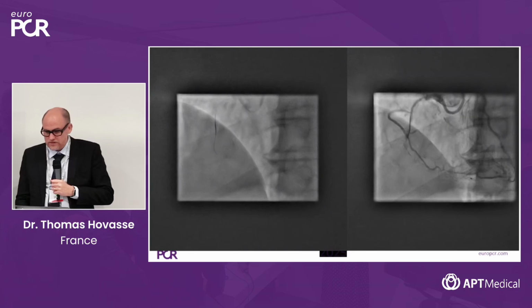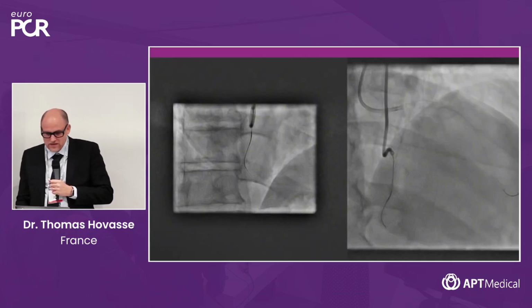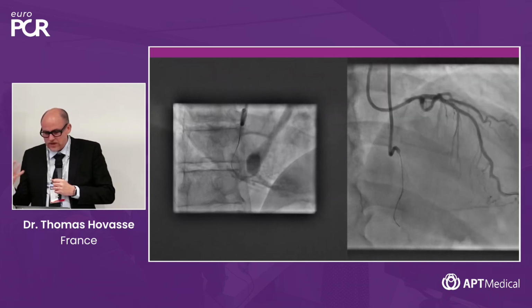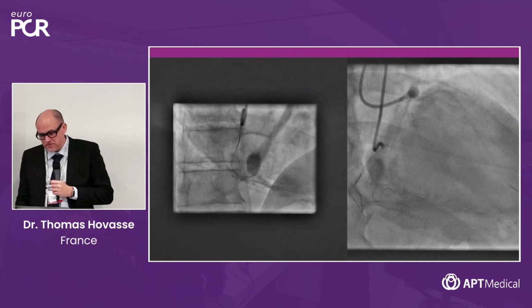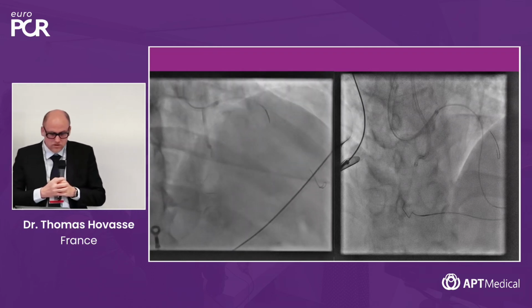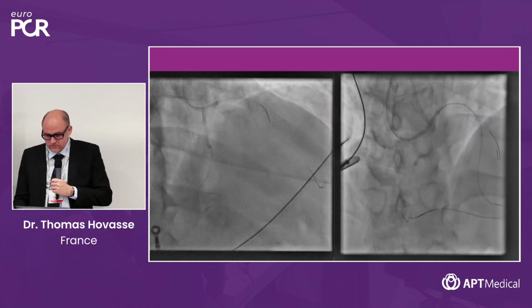So here it seems okay, but not really dancing with the distal part of the vessel. And we have to stop here the antegrade advancement because we were not going anywhere, and soft wires don't work, stiff wires are dangerous because the path is unclear. So again, the strategy was to advance the Corsair retrogradely.